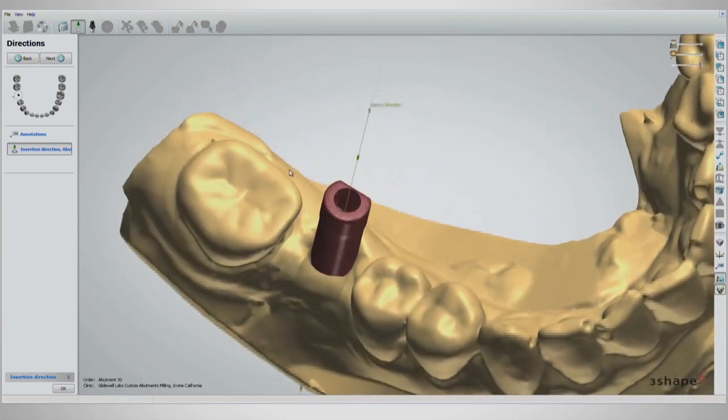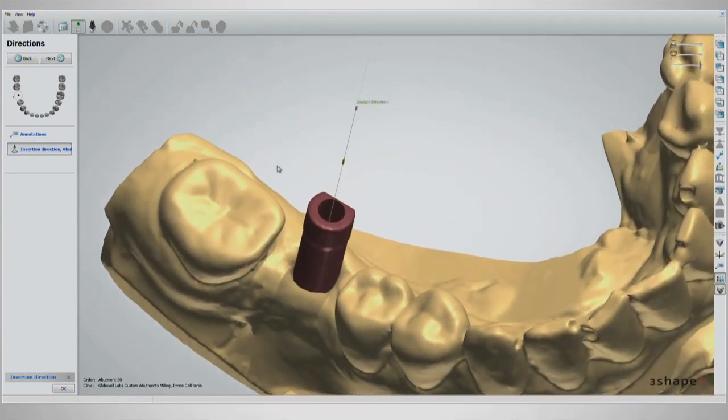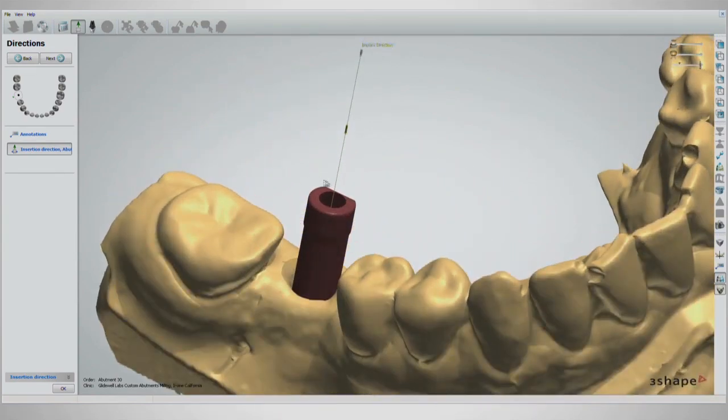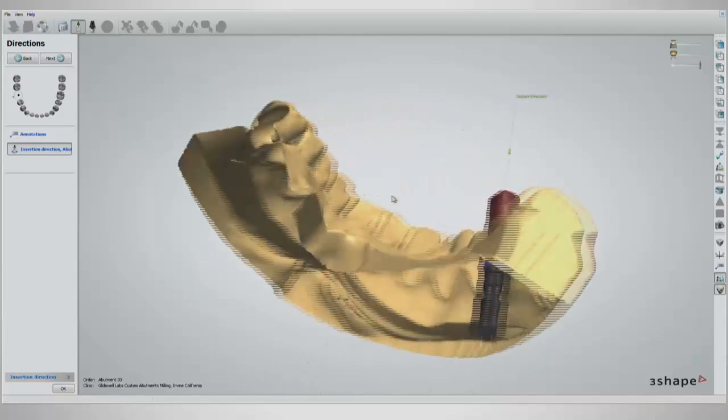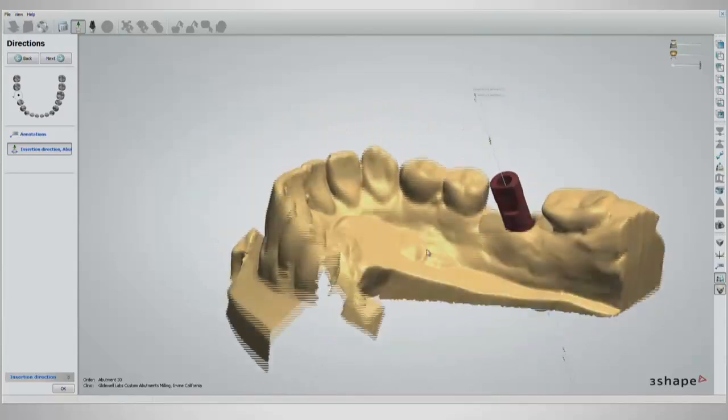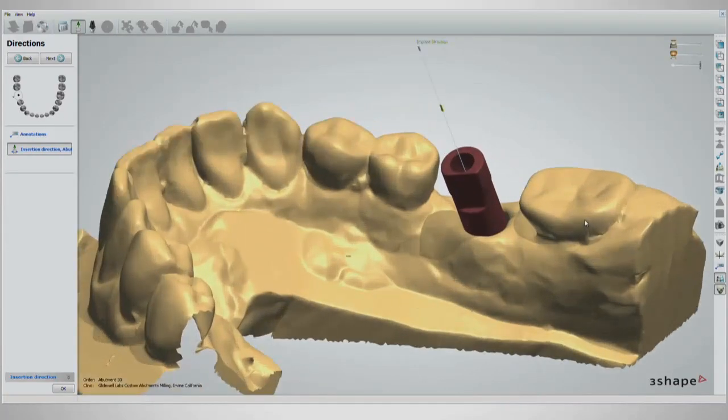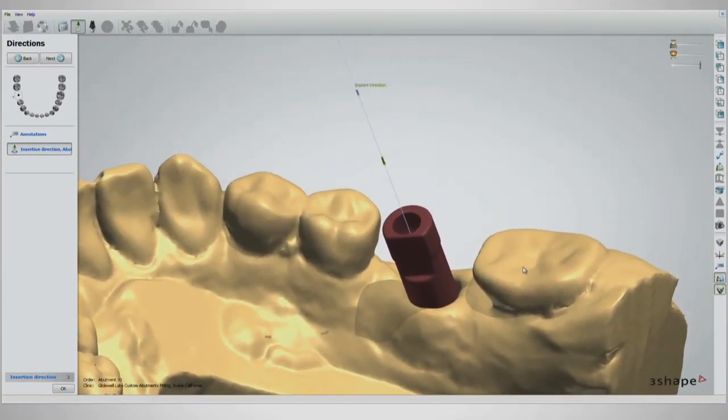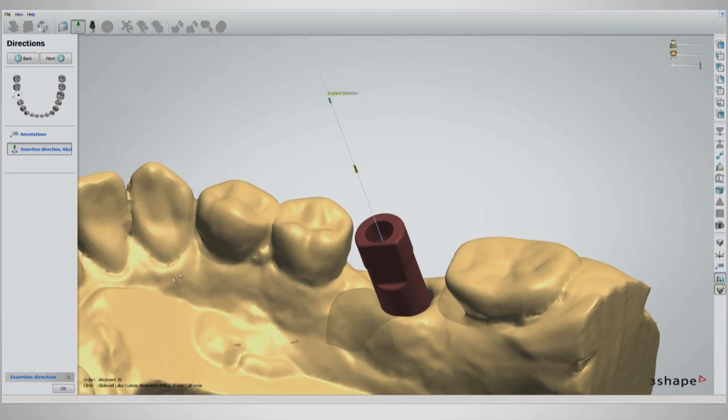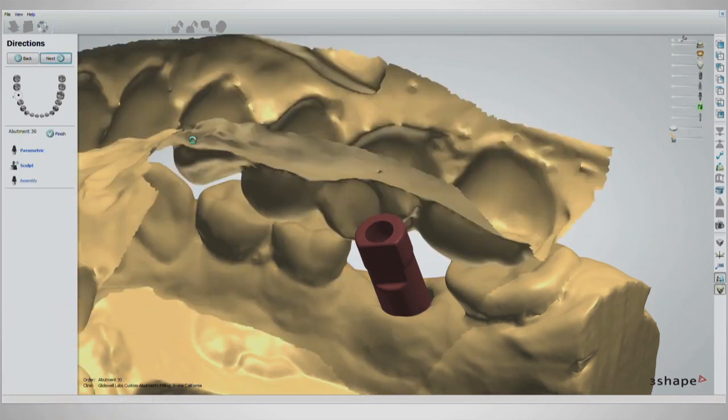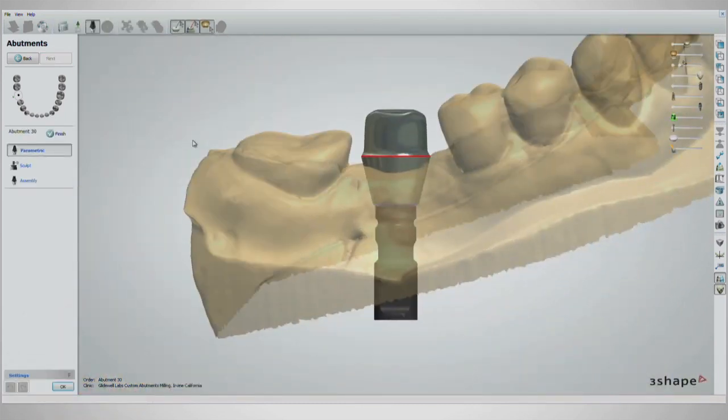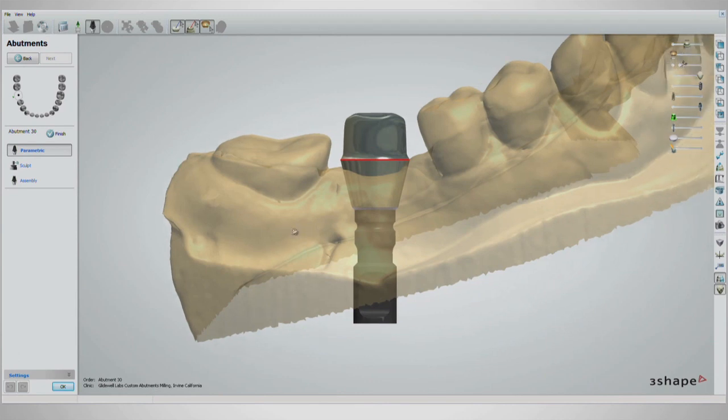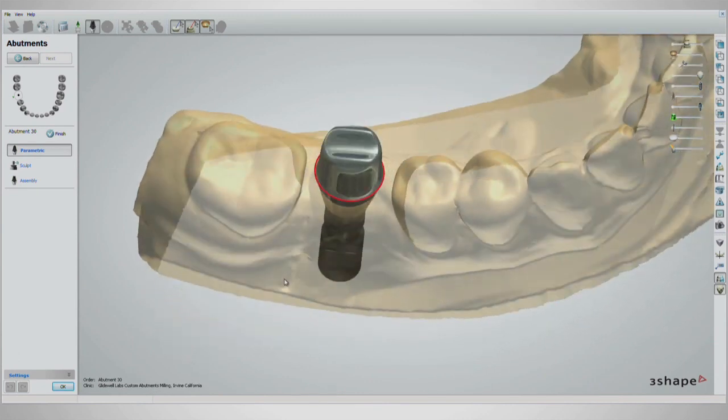An insertion direction will appear with the scan abutment. Since the angulation of the abutment in a later step will determine the actual insertion direction, this page can be skipped by clicking OK to continue to the next page. The initial design setup will appear, ready to be modified to the patient's mouth and implant position.